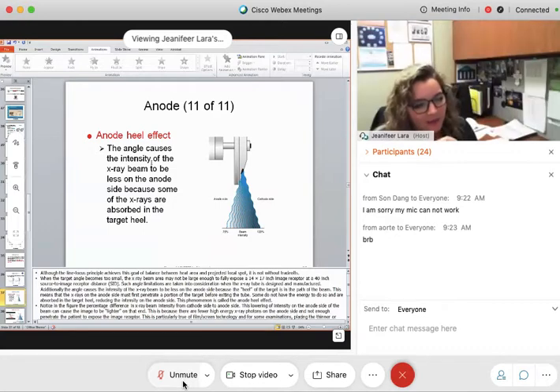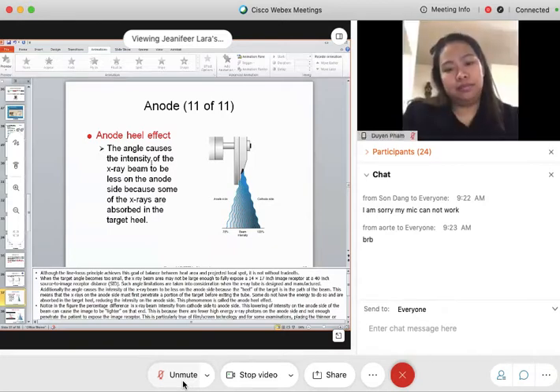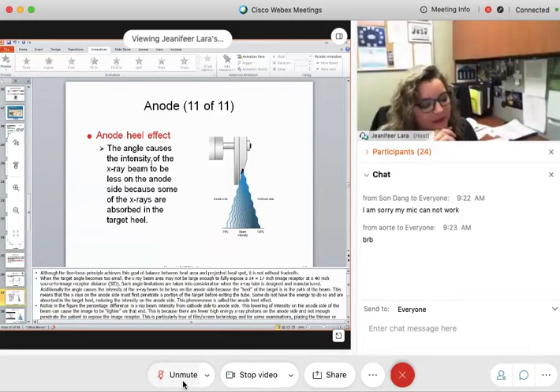The energy of the X-rays? Not the energy. It has to count. The amount and energy of the X-ray? The amount and energy. But remember, if I said you had to pick one of those, which one is most important? Amount. The amount of X-rays.